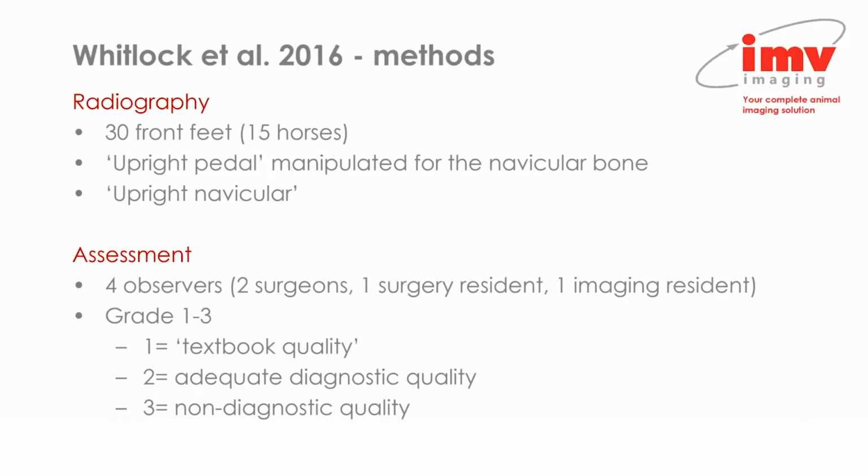So they used 15 horses, both front feet, which gave them 30 front feet. For each foot, they acquired one upright pedal view, which they subsequently manipulated to optimize viewing for the navicular bone, and they took a separate upright navicular view.